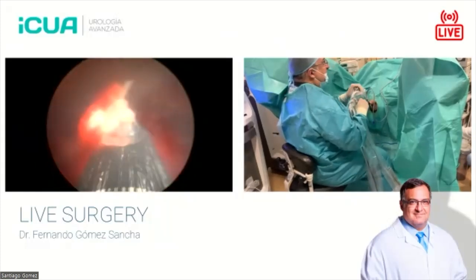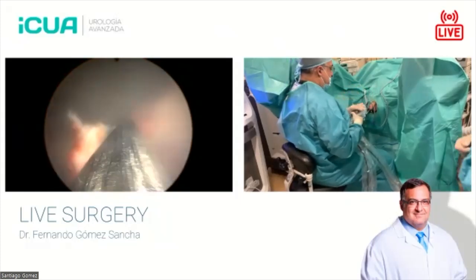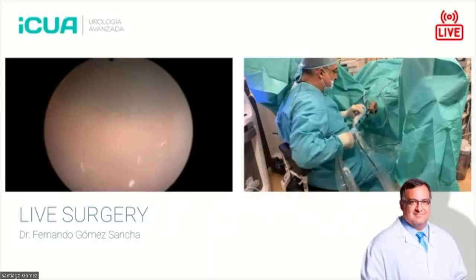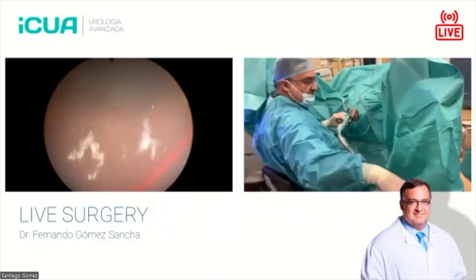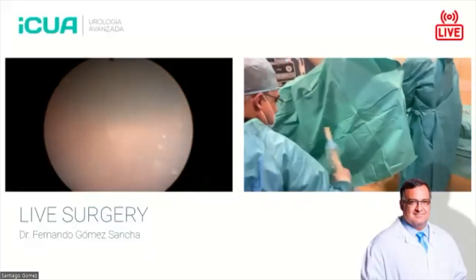You see, we have a very nice fossa with good hemostasis. I'm going to try to do an ultrasound. Let's see if we can check the quality of the job with my ultrasound. So I'm going to take the morcellator out. Now we have to switch to the iPad camera.